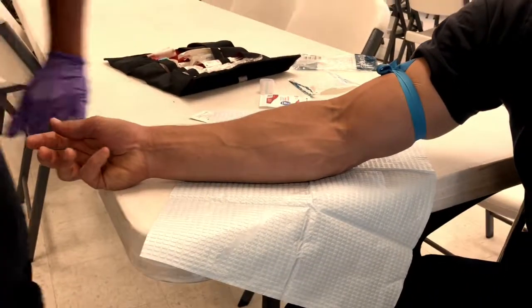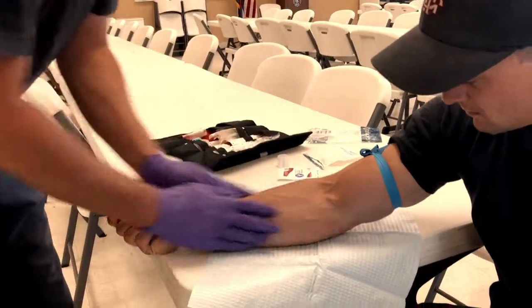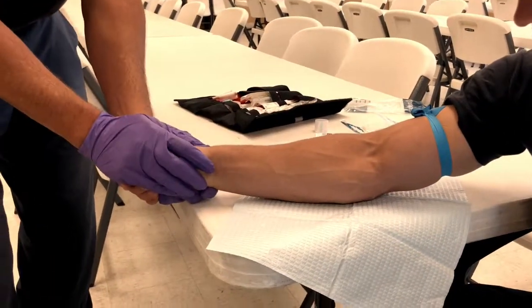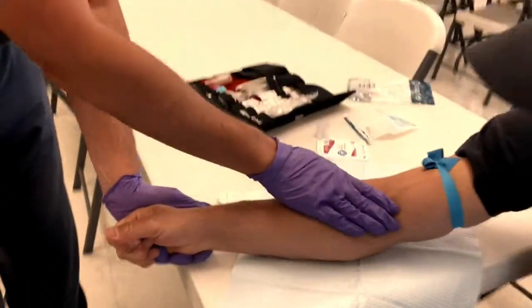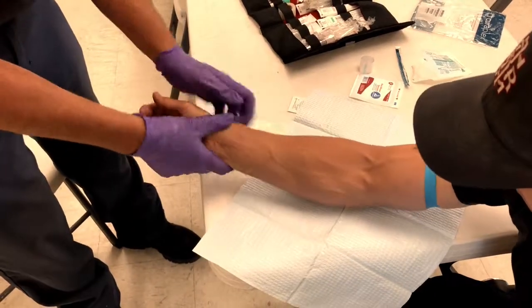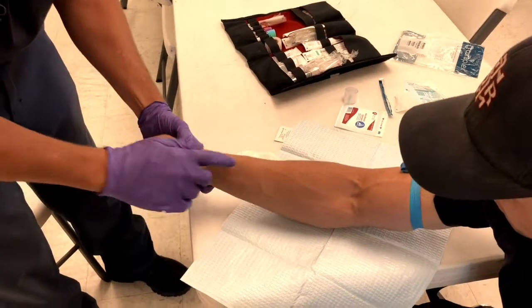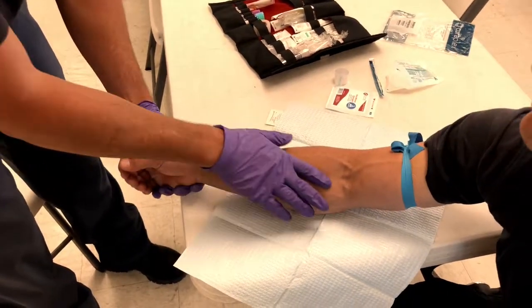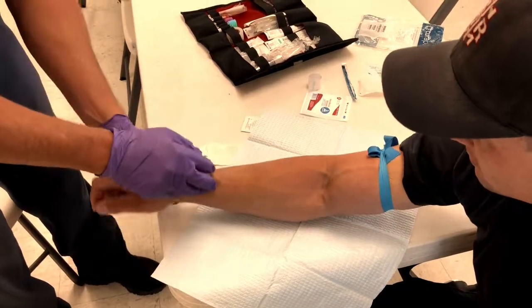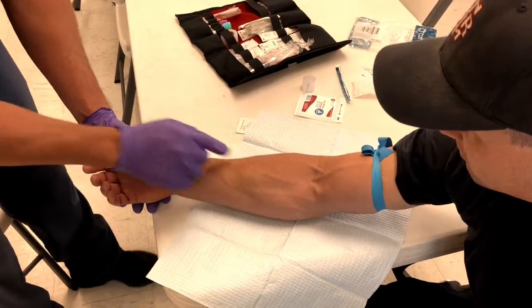So Mesner, tell me what you think about this, but a piece of advice I often give, especially to new providers, is don't agonize over your vein choice. True. I agree. Take a quick look and pick. Yep. Always starting low. If we miss high, it eliminates our opportunity to start an IV low. So we always start low and try and find a good IV low on this patient. And I've identified a decent handcuff vein, but these are good too. Remember, this is a lot more sensitive than up here. So if you have a choice, maybe go on the tougher skin. But if this is your only opportunity, we'll start low.